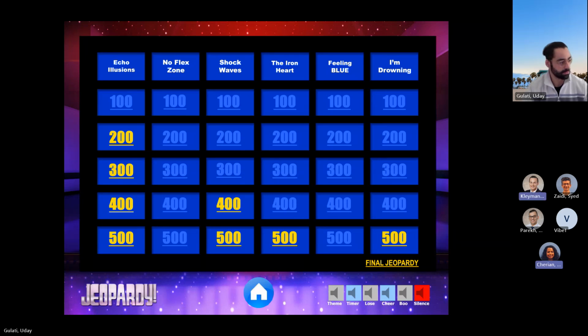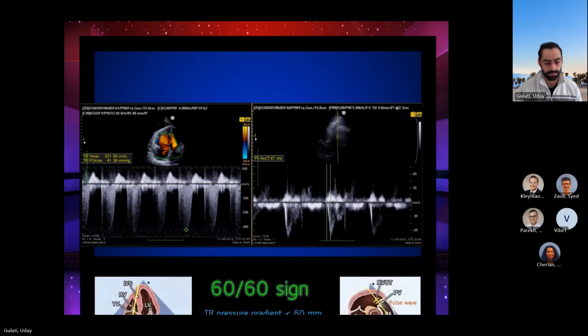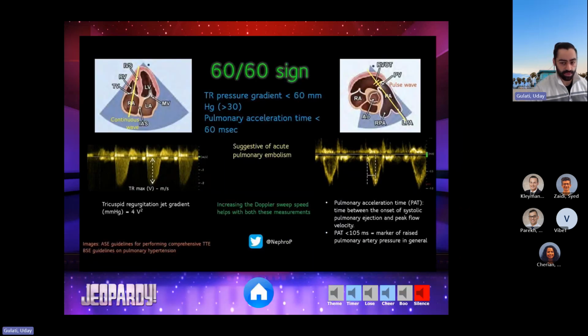Are you measuring the peak height distance, or are we measuring around the curve, the range of the curve? For which one, the TR velocity or the acceleration time? For both, actually. Yes, your TR velocity. Velocity is measuring the peak, but it can be tricky. You're normally measuring peak, but you can also use the part where it decelerates for your diastolic pulmonary pressures, which, don't worry about it.